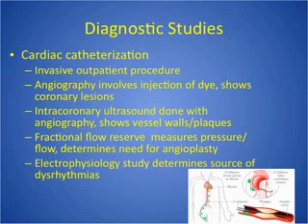Fractional flow reserve uses a wire, so while they're already in there, they can thread a wire up into that catheter to measure pressure and flow in the coronary artery, and then it helps them decide if the patient needs angioplasty or stenting.